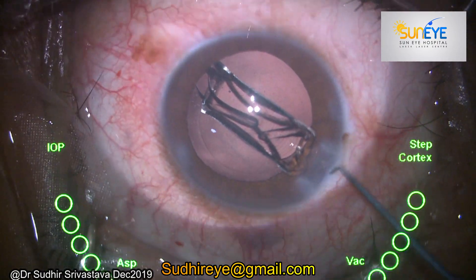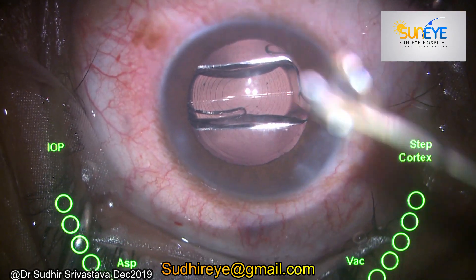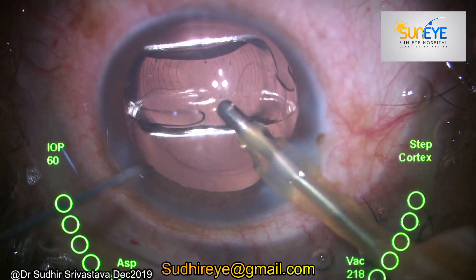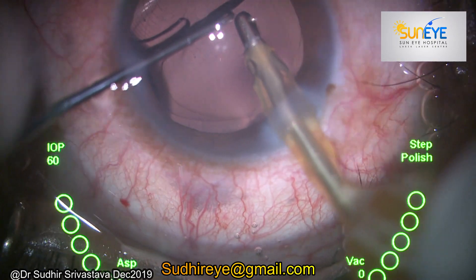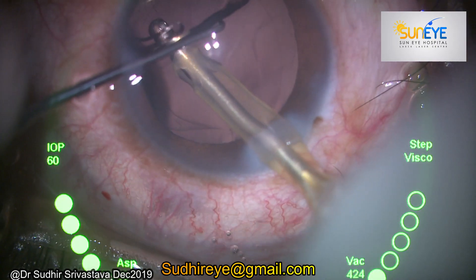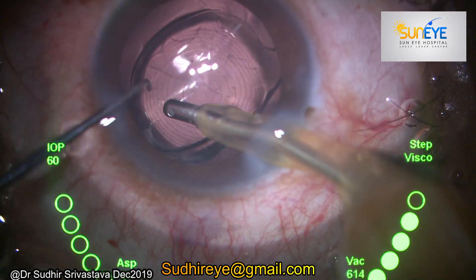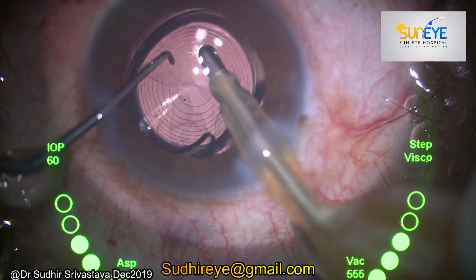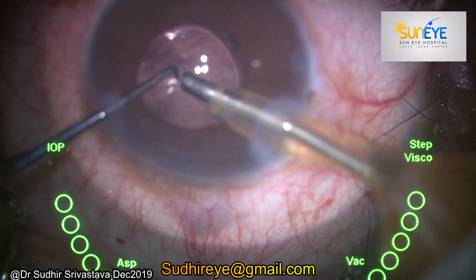After cleaning the bag, I implanted a single-piece hydrophobic IOL implant, which is a progressive implant — or in other words, an extended depth of focus lens. It is always good practice to clean the viscoelastic from behind the IOL, over the IOL, and from the angles. Now watch carefully — I was just cleaning the viscoelastic and there was a sudden decompression of the chamber.